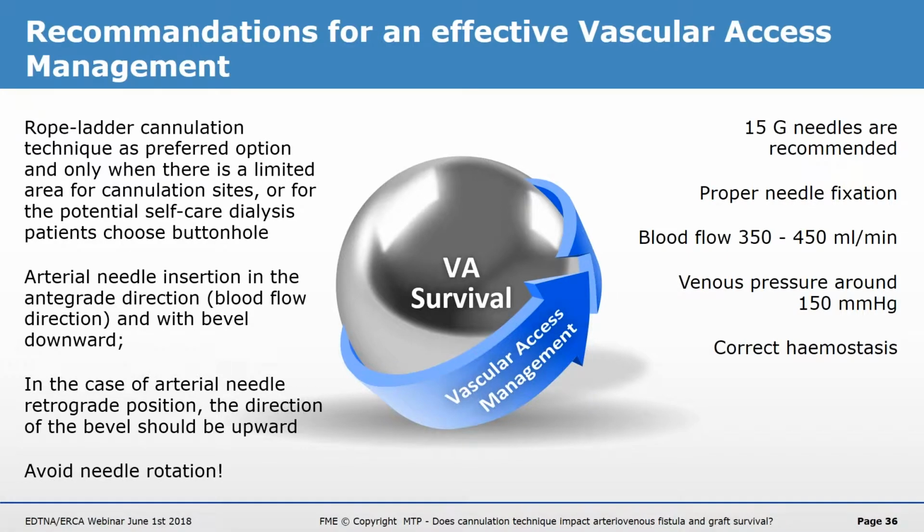Correct hemostasis. This is also a critical point because when the patient is at the end of the treatment, he wants to run out of the dialysis center to go home. And then you have the driver that needs to pick up the patient to take them home, and they are always in a hurry. And then we do not give a lot of importance to the hemostasis. But an incorrect hemostasis is really a risk for the vascular access. So we have to make sure that the patient is giving the right pressure to the vascular access during the hemostasis and for the right time. 3 minutes or 5 minutes of pressure is not enough. We need to stay at least 8 to 10 minutes.